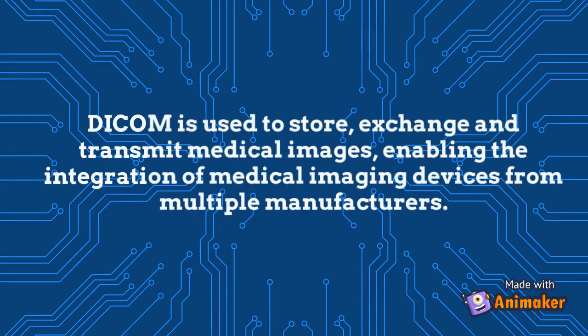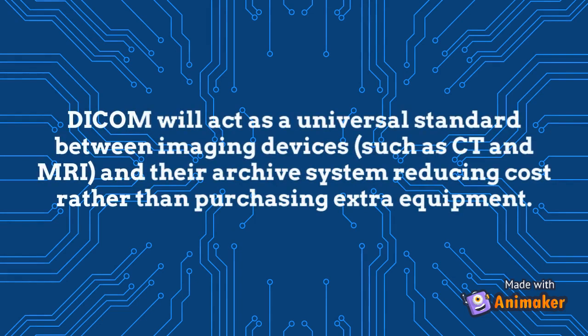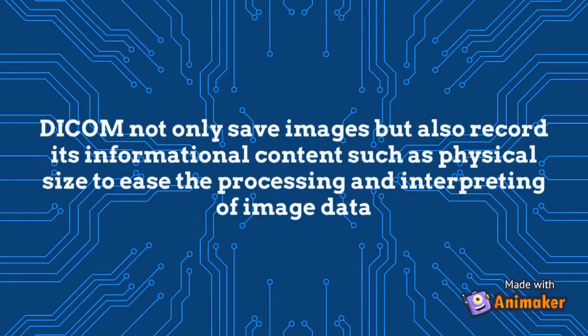DICOM is used to store, exchange, and transmit medical images, enabling the integration of medical imaging devices from multiple manufacturers. DICOM will act as a universal standard between imaging devices and their archive systems to reduce the cost rather than purchasing extra equipment. DICOM not only can save images but also record their informational content to ease the processing and interpreting of the image data.